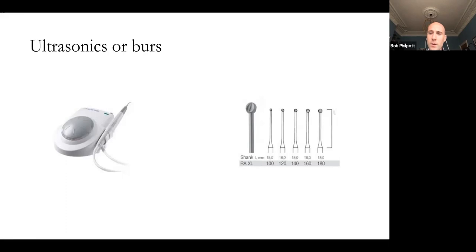Now you've got to be appreciative of the fact that they are different sizes. That's what you're taking caries out with, generally speaking, whereas you're using a lot of 100 and 120s. But when you use a burr like that, it will create minimal debris, because of the speed that the burr is rotating and you have suction on it, often that debris is coming back out. Whereas you won't have that with an ultrasonic. And they're way cheaper in comparison to investing in something like that.